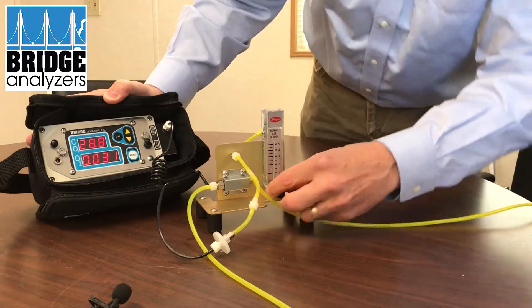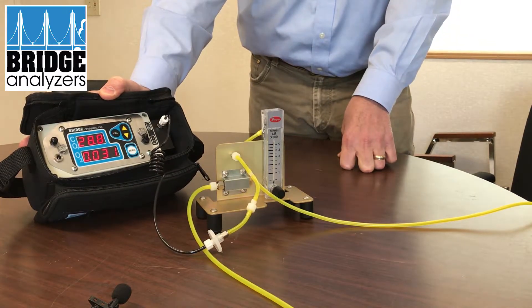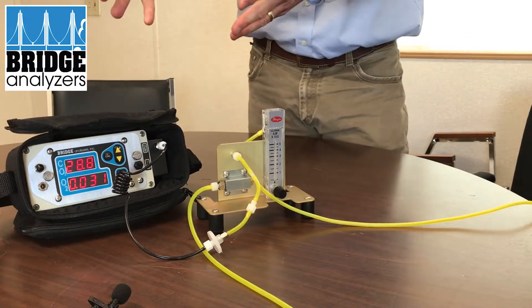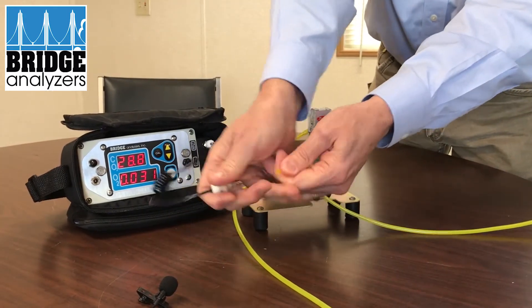Here you can see again we're at 29% CO2 and 0.031% oxygen. So I can with pretty good confidence say I know I'm getting a good result. You can unplug and make your way to do more testing.